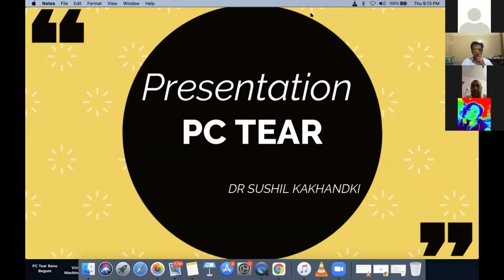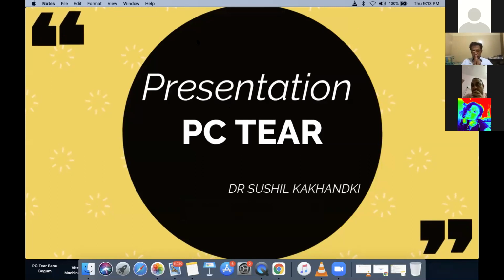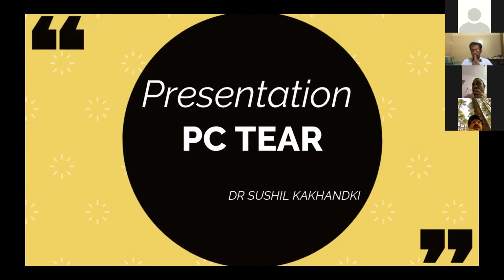The second most important thing I feel is extraocular ergonomics. It is very important to have the operating eye placed horizontally, and we have to be very cautious if it is a deep set eyeball with a narrow palpebral fissure, and take extra care about the speculum, because in such cases the speculum will unknowingly be pressing upon the globe. That itself is a predisposing factor for a posterior capsular tear. There are many other factors that can lead to a tear. It may be a small pupil where visibility is less, or a shallow anterior chamber where the chances of your instruments hitting the posterior capsule are very common, or a thin posterior capsule, especially in cases of a hard cataract, because of overstretching of the capsular bag due to large volume. That makes a predisposing factor.